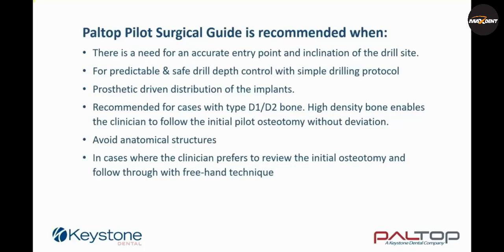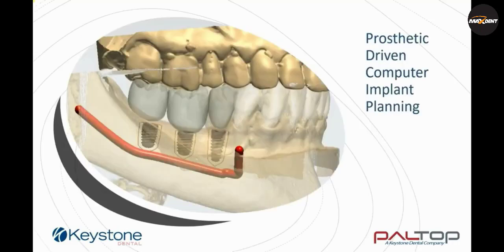Use a pilot guide to avoid anatomical structures. And for cases where the clinician prefers to review the initial osteotomy and follow through with freehand technique. Here we see the prosthetic-driven implant planning.